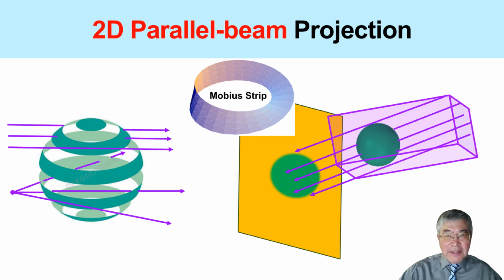But in three-dimensional space, we are not limited to rotating around only one fixed axis. We can illuminate the object from many different orientations. In principle, the projection direction can follow a much more general trajectory. The Mobius strip shown here is a way to suggest that the possible orientations of projection planes in three dimensions are richer than in the simple two-dimensional case.